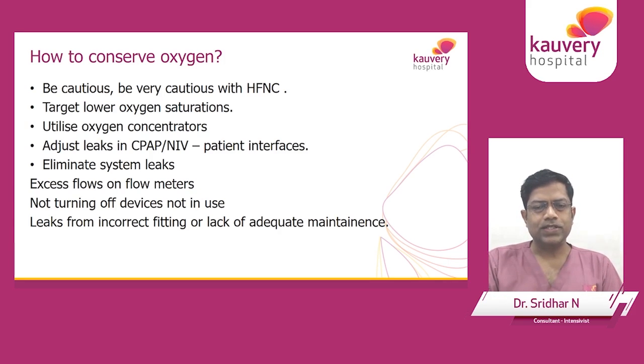Utilizing oxygen concentrators. So most hospitals almost never used oxygen concentrators. We never used oxygen concentrators in a hospital. But following the challenges we are having with procuring oxygen, we have procured at least 12 oxygen concentrators that I can think of. They're high flow ones, 10 liters per minute. And now we are using them inside the hospital to conserve our oxygen for those who need it desperately on either CPAP or ventilator modes or non-rebreathing bags.